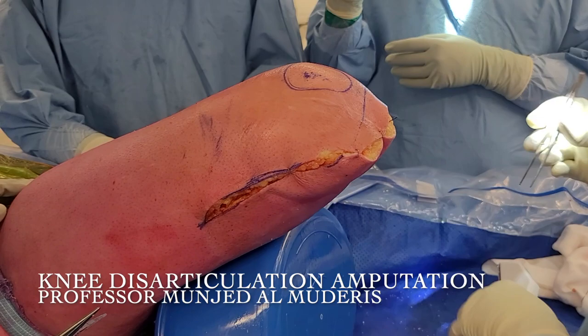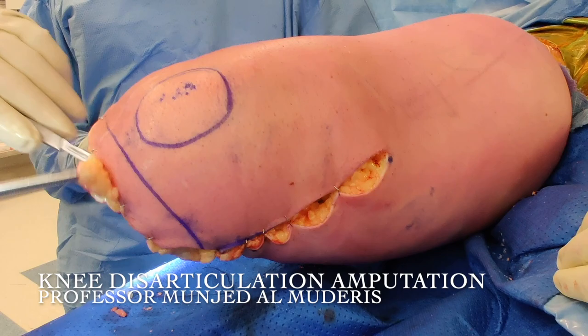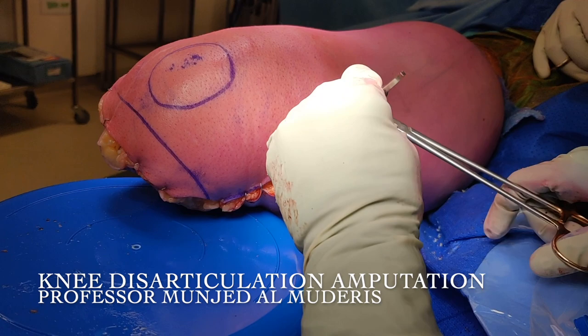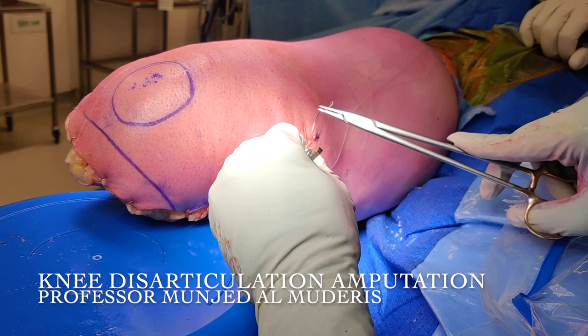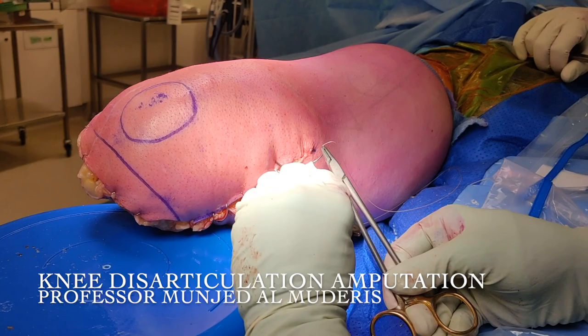I temporarily put staples to identify my closure below the wound. Often you may see an end wound that looks like a Mercedes-Benz sign, and that is due to the overhanging of medial tissue. Closure is performed in layers — a deep fat layer and approximation of the skin edges with clips, ensuring that we can adequately close. Then we proceed to the subcuticular running suture layer. The aim is to close the medial side first, which will often be tighter due to the abundant tissue resection, and once that is closed we proceed to the lateral side, which completes our closure.